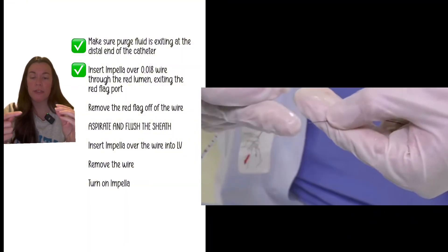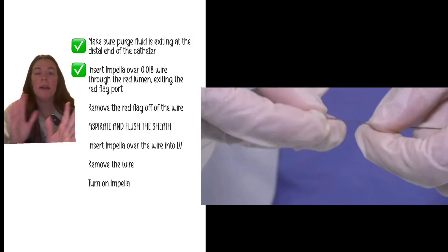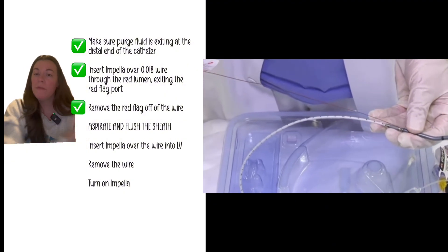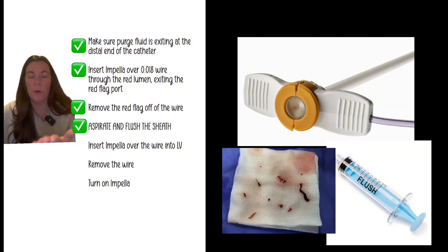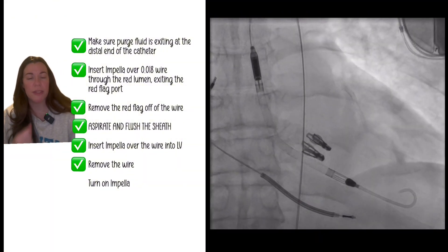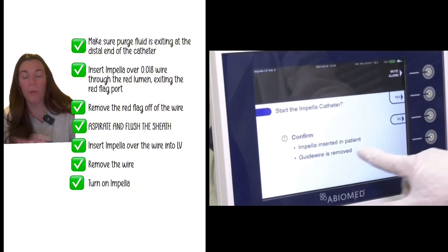With ACT over 250 or 300 and the sheath aspirated and flushed, insert the 0.018 wire through the red temporary lumen on the Impella — this facilitates proper passage through the correct windows. You'll see the wire exit the back end of the red lumen with a little flag; remove the flag once it's through. Aspirate and flush the sheath one more time to ensure no clot. Then, using the monorail system, pin the wire and insert the Impella into the left ventricle. Remove the 0.018 wire when in good position, then have the circulator turn on the Impella on the console — it will prompt you to confirm the wire is removed before starting.